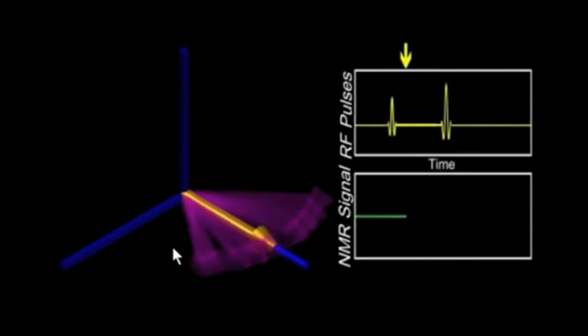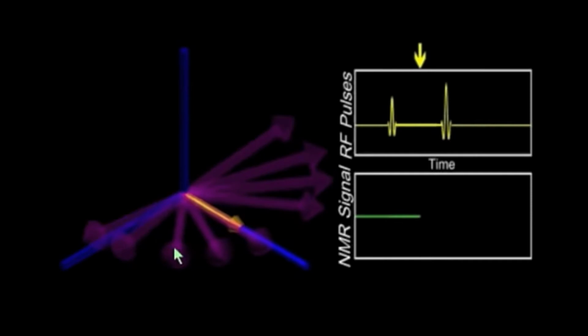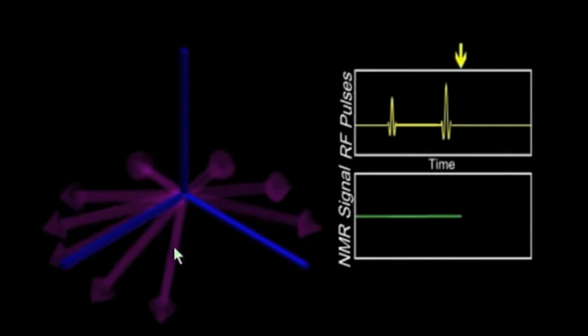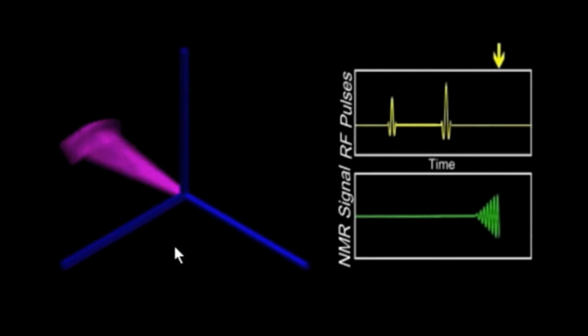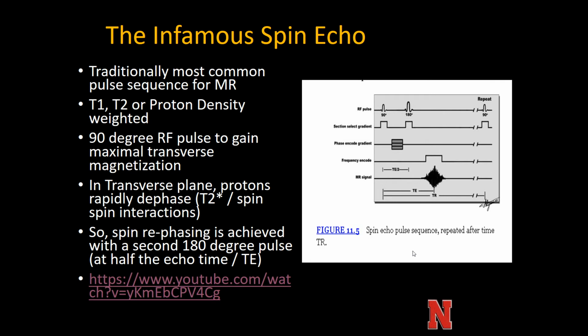Okay, starts to decay away, so they're out of phase. So if we measured at this time, we see the signal is diminishing. They get out of phase, it tends towards zero, and then we flip them around the other way in the rotating frame of reference, the fast ones catch up with the slow ones, and there we go. A sort of bada bing, bada boom, they refocus, and we measure them now, the signal comes back. And if we let it go further, the signal goes away again. So there you have it.